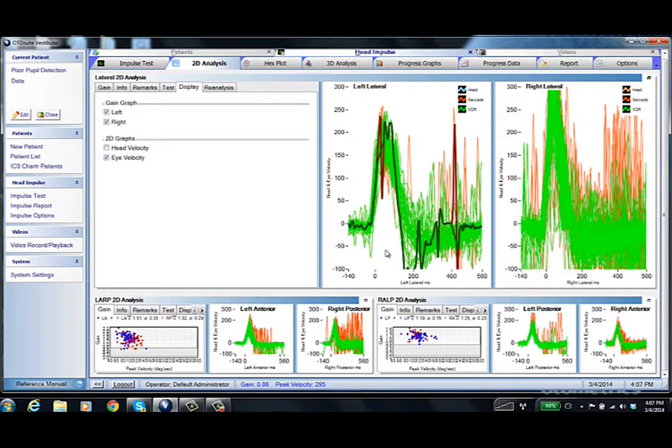If that isn't good enough, then I suggest using those little plus minus buttons to tweak it to get a better pupil detection. And then turn on the laser dots, have them look left at the laser dot, have them look right at the laser dot, and make sure that pupil's tracking before you go on to calibration.